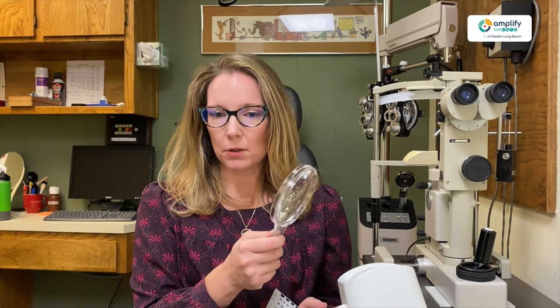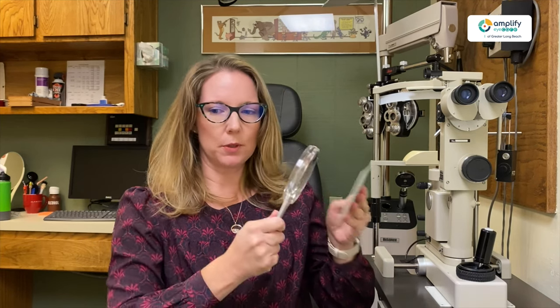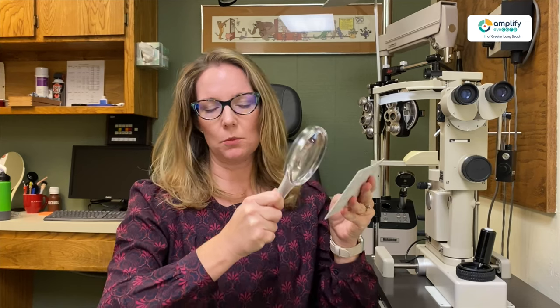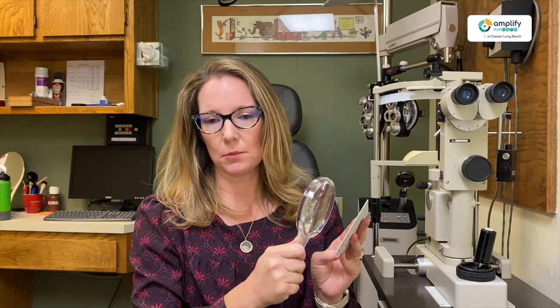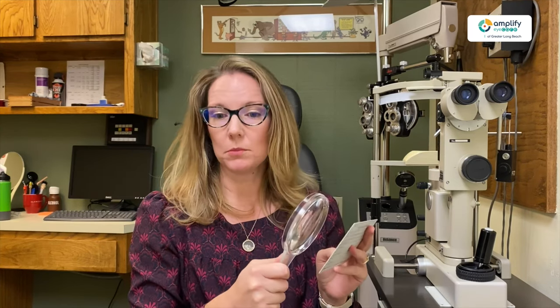But if you were trying to read a newspaper or something with a magnifier like this, it would take so long — you'd have to keep moving it around. So it's not very practical for long-time reading. That's because of the field, like how much you're seeing in that. You have a smaller view for sure, and you're doing a lot of maneuvering between your hand and the page, and it doesn't always kind of flow nicely. So that's where it becomes cumbersome.